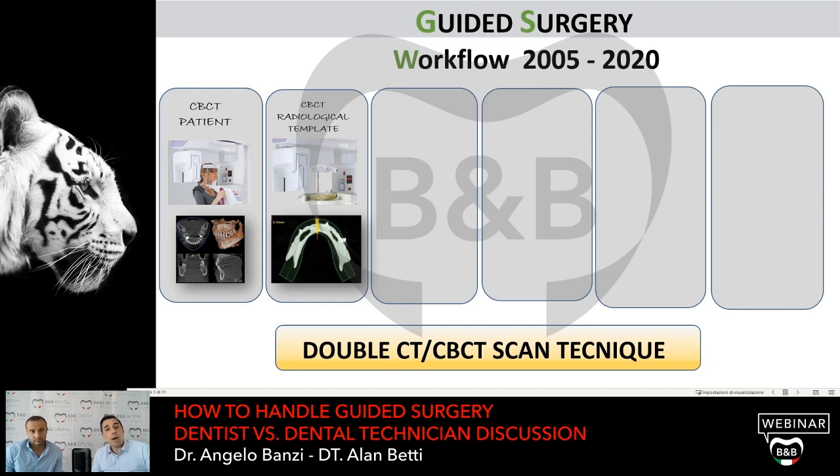Because we have in the digital project the position of the teeth, and we can put the implant in the right position according to the prosthesis. Yeah, guided by the teeth of the prosthesis. Yes, good. So, in the end, we can say that the radiological template can be done with a different material.